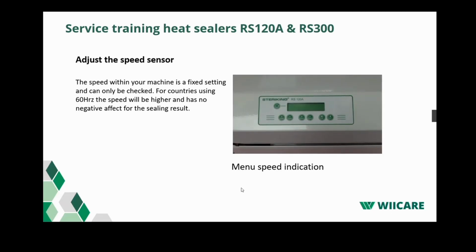To get to the menu where we can read the speed, we have to do the following. When we turn on the sealer, we have to press the off button at startup. Then press the on button until you are in the menu where you can read the speed.